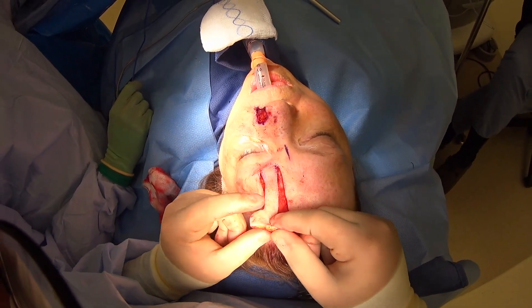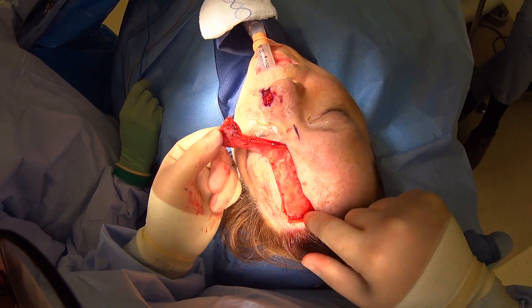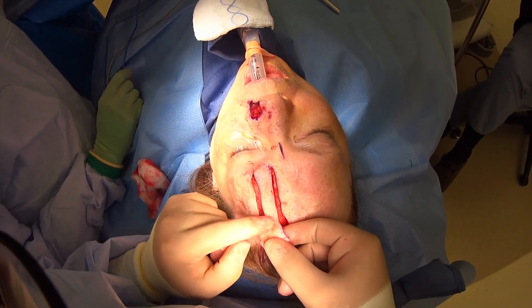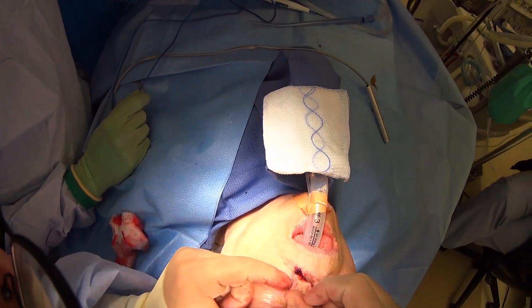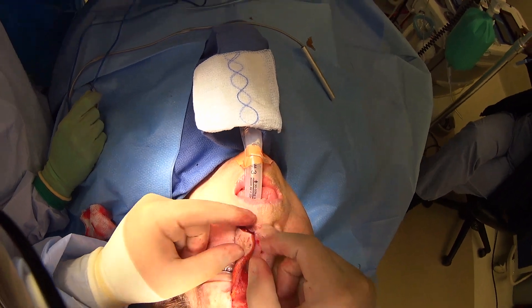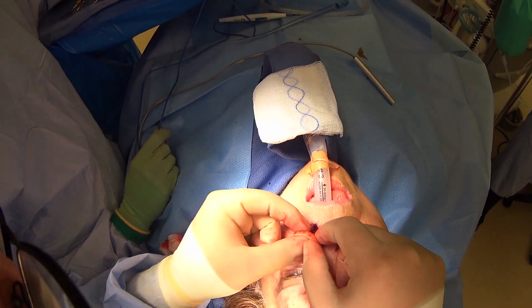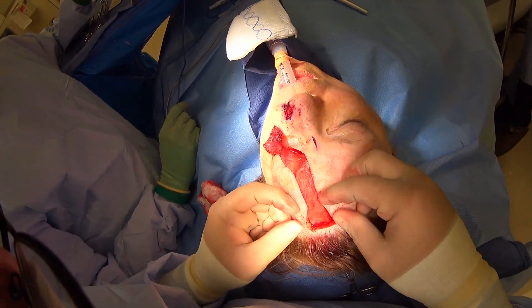Now we've been able to lift our flap. You can see here this is some of the frontalis muscle, here's the periosteum — it's amazing how this little blood vessel can come all the way down and supply this entire flap. We'll rotate it and you can see how it fits nicely in position. Even with this thin forehead skin it's still a little thick, so we'll come back, thin it all, and inset it. Now we're going to close all of this.